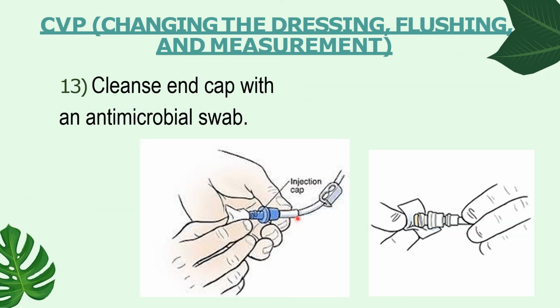So now you can cleanse the cap with an antimicrobial swab. So as you can see in the picture, for at least 20 seconds.